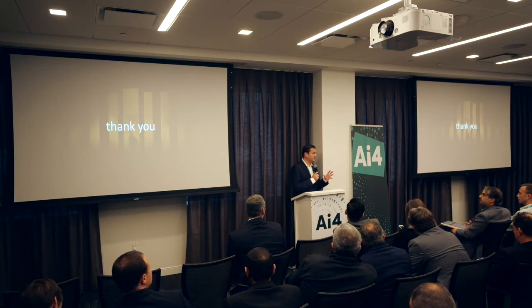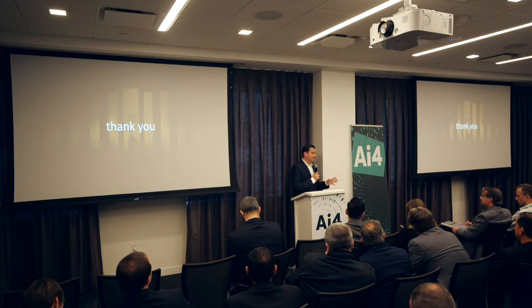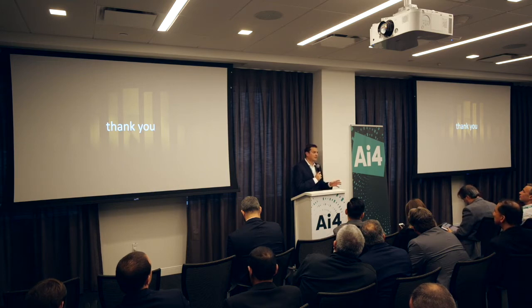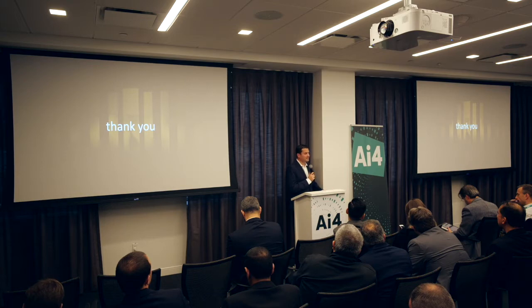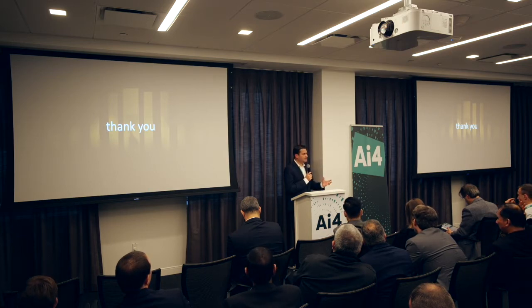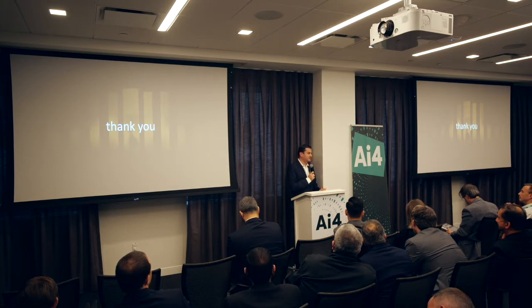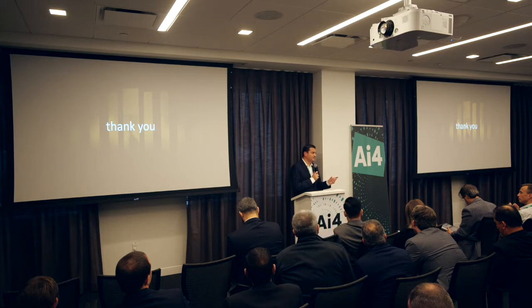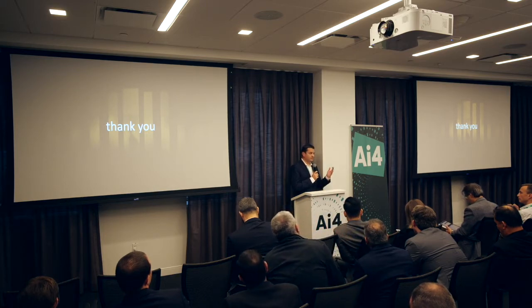The grapher can fine-tune the technology behind every case separately, so it can identify which graph is the best. But for most of the ones that you've seen here, the algorithm behind it is referred to as the alpha tree algorithm. It structures the image information content in such a way that it clusters pixels together based on similarity criteria that can be as simple as intensity, so any two pixels with similar intensity can be put together, all the way to super complicated criteria.